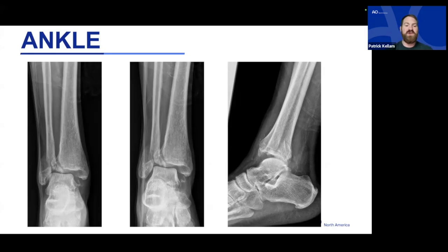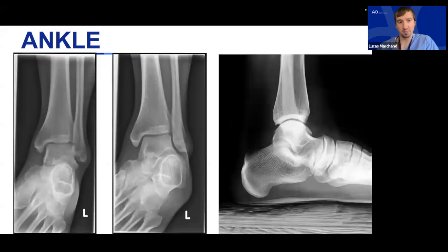It just gives you a sense of what you need to do to reduce it, and then you can get those images. I think that's exactly right. And that's why it's important to know what the good images look like. As you reduce the limb, you should start seeing sort of return of that normal anatomy and radiographic parameters.